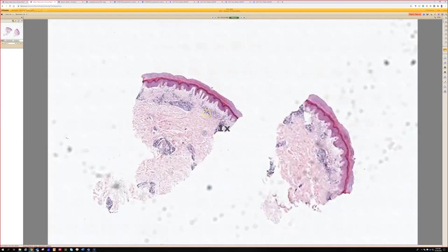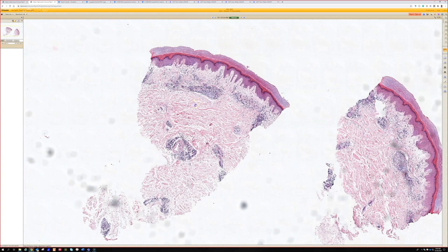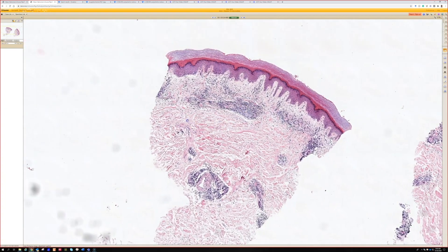Okay, case 24. This is an acral site — there's papilloderma and a bunch of lymphocytes, so this is perniosis. Perfect example. Acral skin, abundant edema in the papillary dermis, superficial and deep lymphocytes — perniosis.